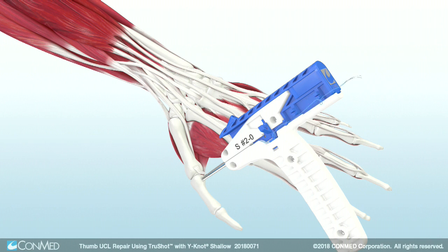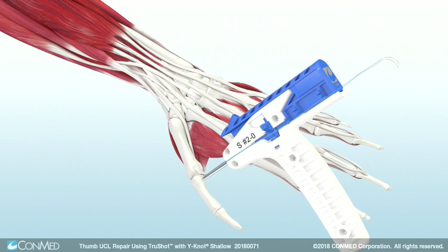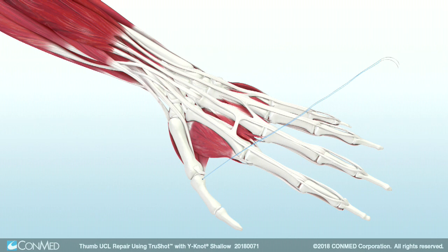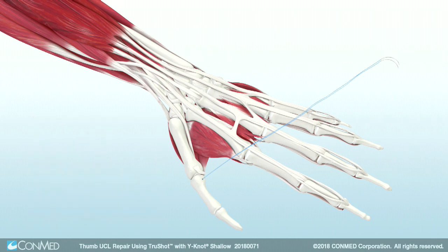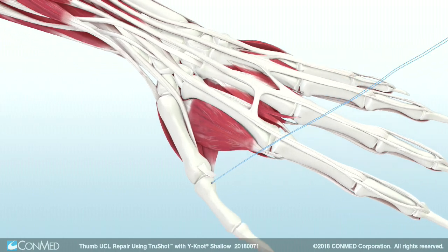Uncleat and remove the suture with needles. The TruShot is then removed from the surgical site. After deploying the anchor, apply tension to the suture limbs to confirm the stability of the anchor.